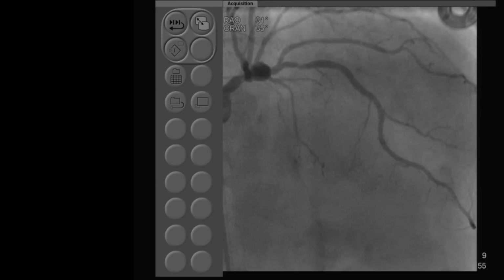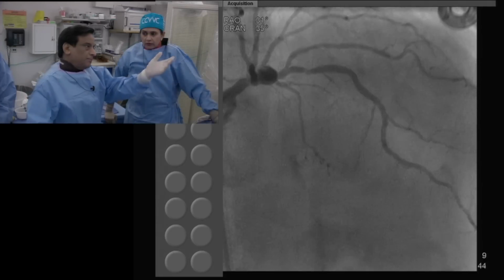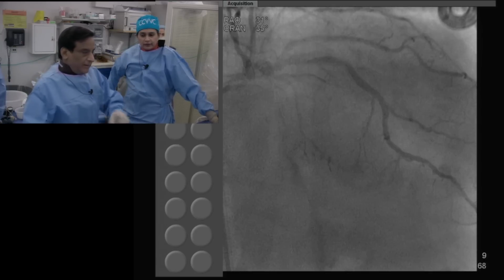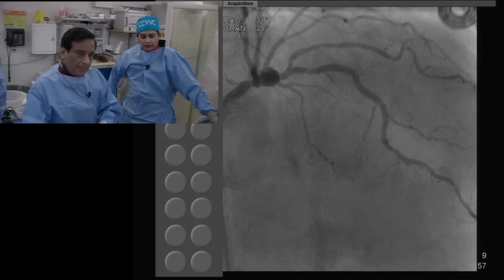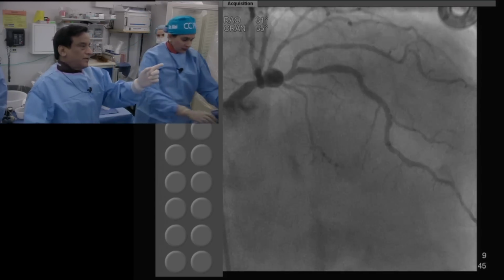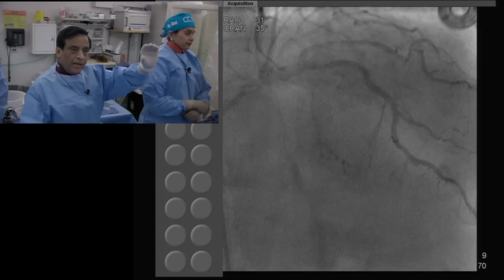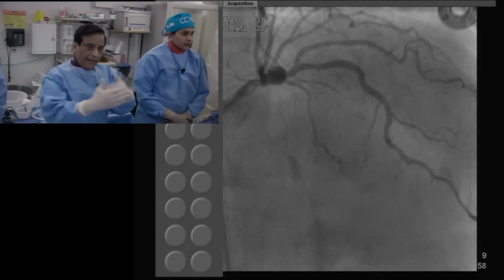We actually have a publication. We had a giant aneurysm, 12 millimeter in size. This probably will be around 12. Actually, that one was 22 millimeter of the right coronary, which we put a stent in, and that aneurysm closed, and we showed a follow-up CTA, and that paper was published by one of my fellows in Catheterization and Cardiovascular Interventions. So here what we have to see is what's happening with the ostial circ. Once you put a stent across from the left main to LAD, the aneurysm will become one third the size. Because there is no flow, it just falls down.